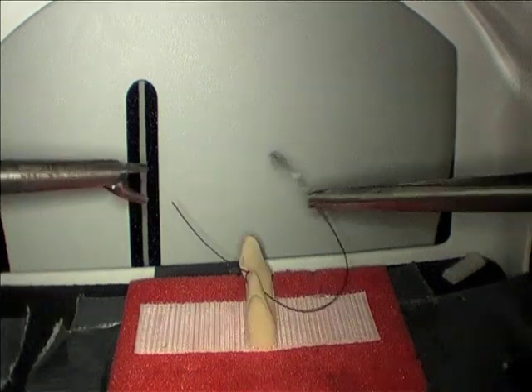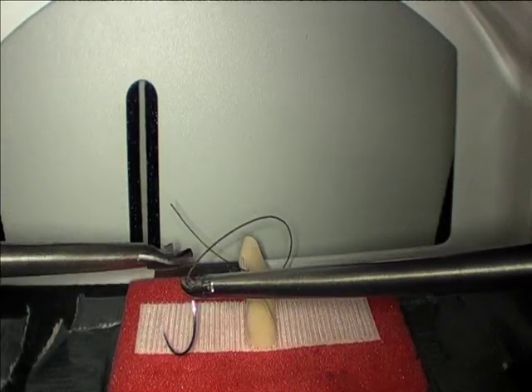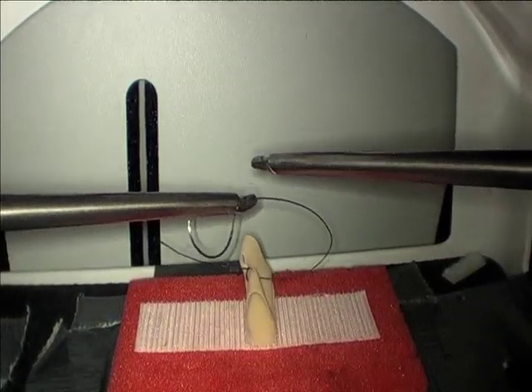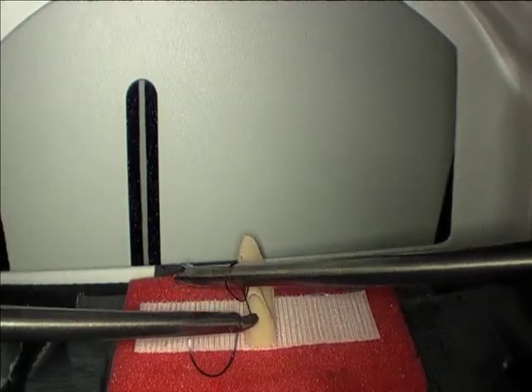Next, flip the suture over and grab it in your left hand such that the suture is coming out of the tip of the needle driver. Again, bring your needle driver over the suture, through the C loop, and grab the tail of your suture. Now pull it back through.